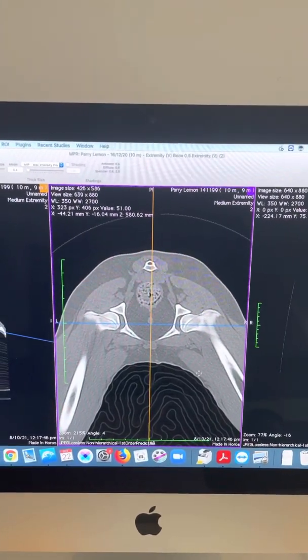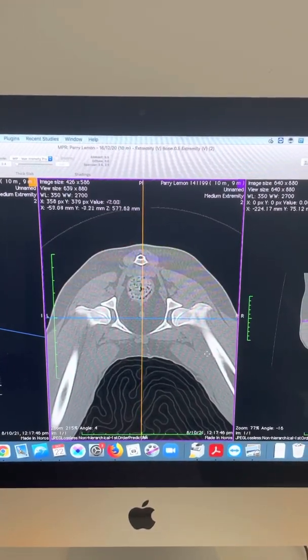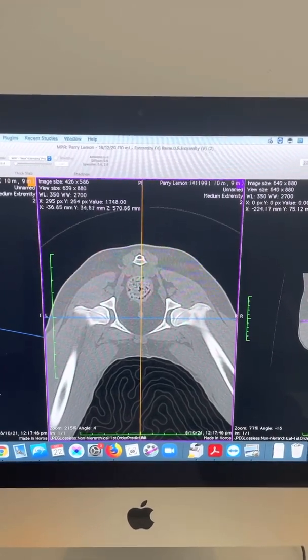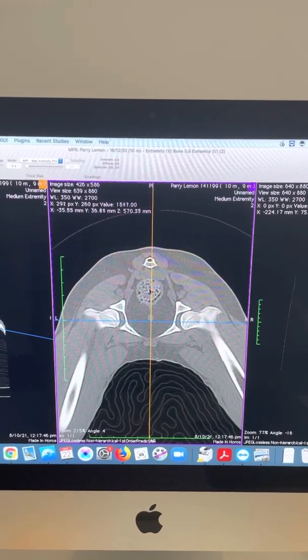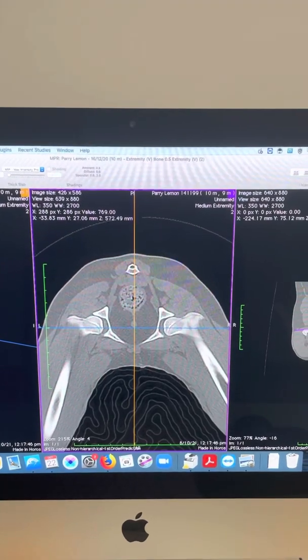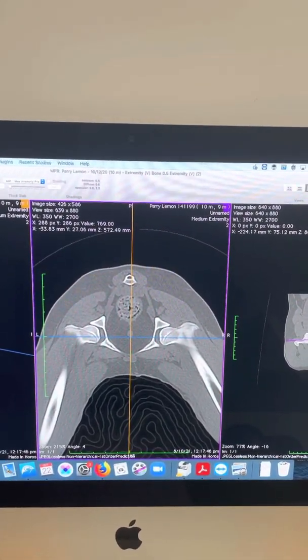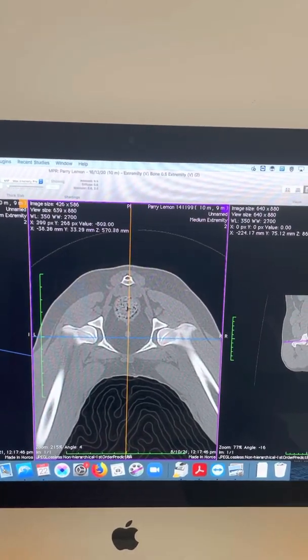We want to look at the CT scan and get a sense of whether there's any pre-existing arthritis. If there's no arthritis, they're a good candidate. I also look specifically at the dorsal acetabular rim — is there any blunting or evidence of remodelling? That's one of the earliest places we'll start to see remodelling. If they have a nice crisp Ortolani sign, they would typically make a good candidate because they haven't got a lot of remodelling and damage to the dorsal acetabular rim.